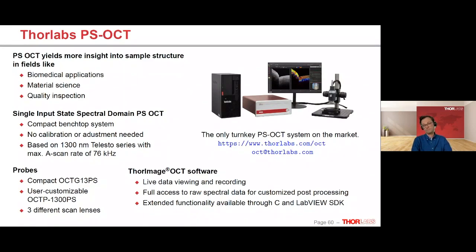So if you can live with a very small B-scan of, say, only 100 lines, you're already getting to a frame rate that is below a second, but it's of course not then in the kilohertz range.